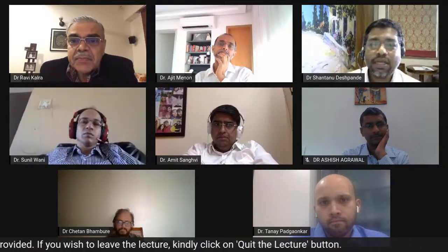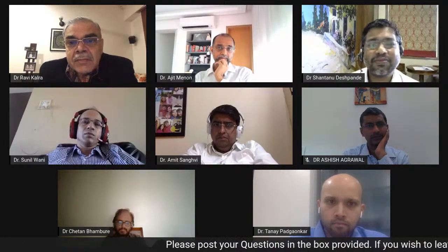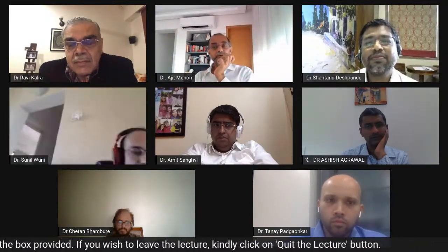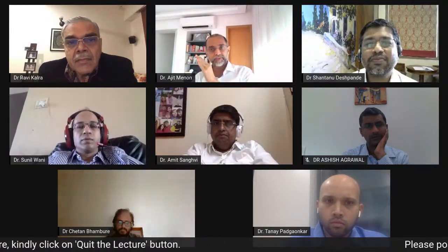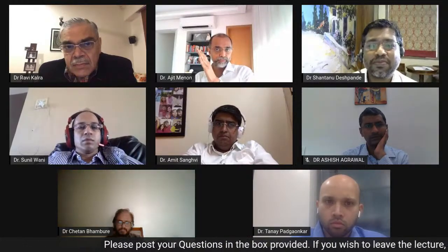Yeah. So he was lucky to get it out. And DK crush. Dr. Menon, what would you have done? See, like I said, for me imaging would have played a role because it would have helped me determine what the type of lesion is there, if the lesion in the diagonal looked significant, at least angiographically. So in all probability, mentally you're ready to treat the diagonal also.